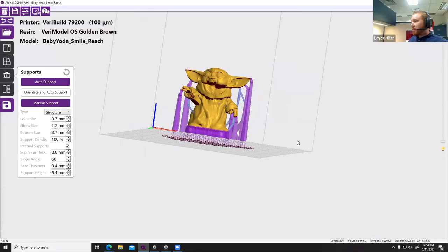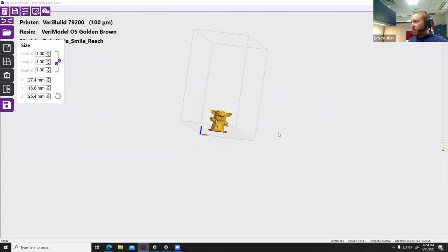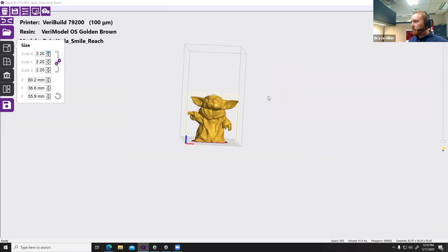Cool. So that pretty much covers supports. Some of the other basic controls here, we have scale. So right now I have a baby Yoda and I want to print a daddy baby Yoda. So I can just increase the scale here. So now my baby Yoda is bigger.